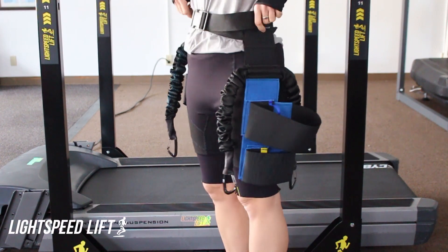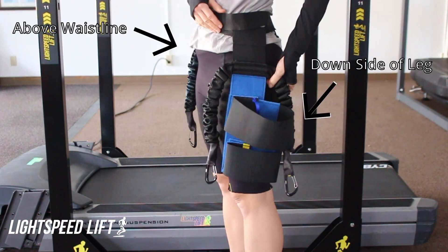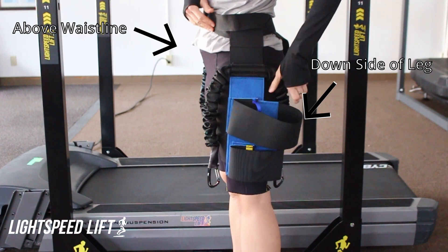We're going to demonstrate how you put on the universal lift belt, which is designed to fit right over clothing or leggings. You'll notice that the belt itself is fastened just above the waistline. The straps hang straight down the side, maybe even a little bit back behind center.